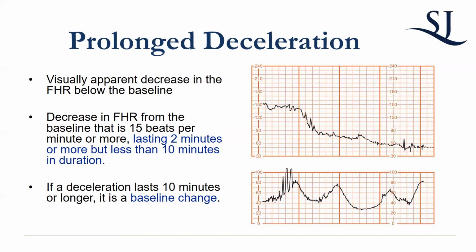But look at this now. You have 1 contraction, 2 contraction, 3. Each one of these is a minute, right? We don't have 10 minutes, but you could probably figure what's happening here. There's too many contractions, right? That's called tachysystole. So you can give a medicine that would relax the uterus temporarily to relieve this, and then it goes up. Because there's nothing wrong with baby. It's just that baby can't breathe because of the contractions. Once that's relieved, it'll go back, and that's also how you know that there's not a worse problem with baby, right?